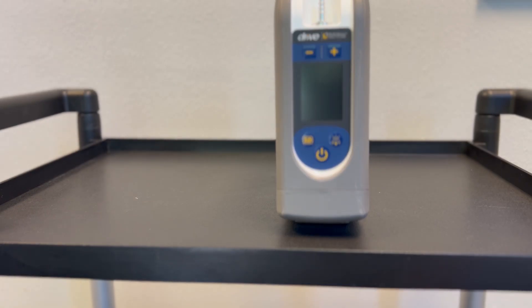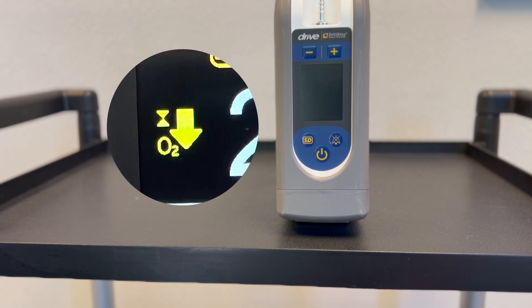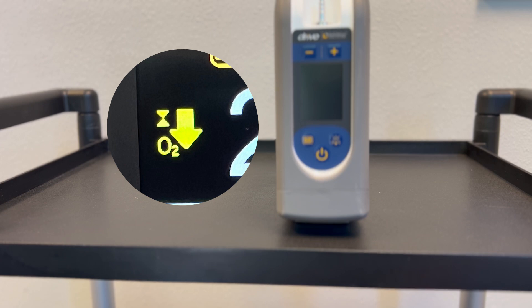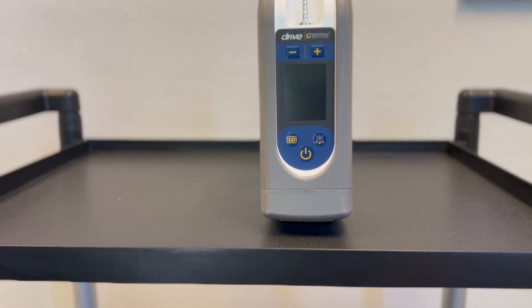When you start your iGo 2, you will notice a yellow triangle pointing down. That will stay on for up to 10 minutes as the iGo 2 is getting up to operating specs — specifically building up oxygen purity to medical grade. Once the machine is up to operating specs, that message will clear.